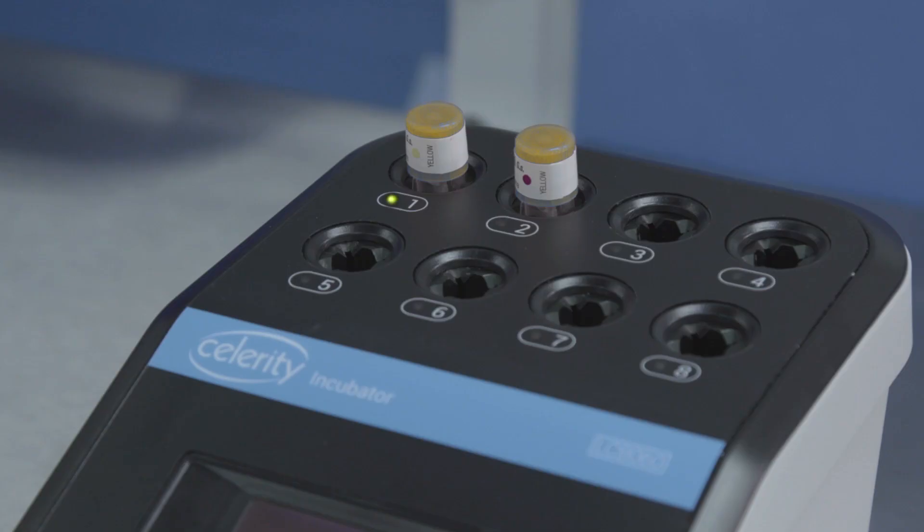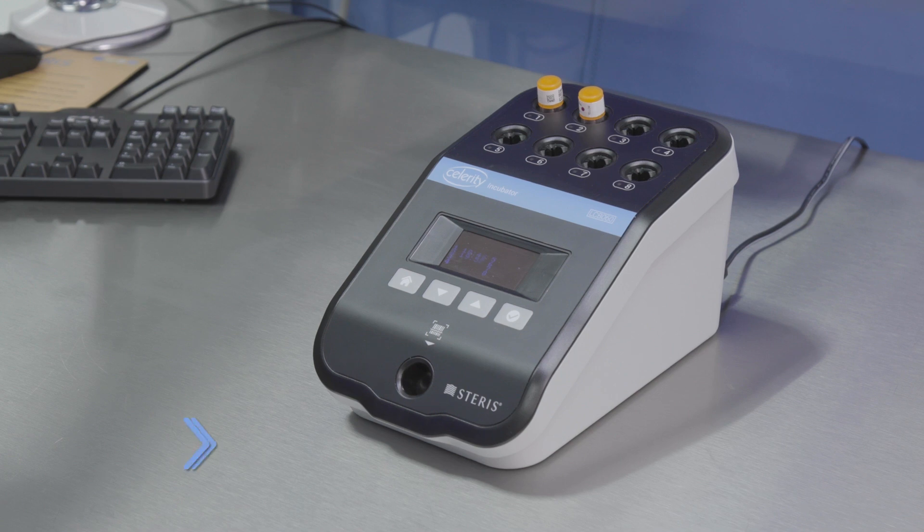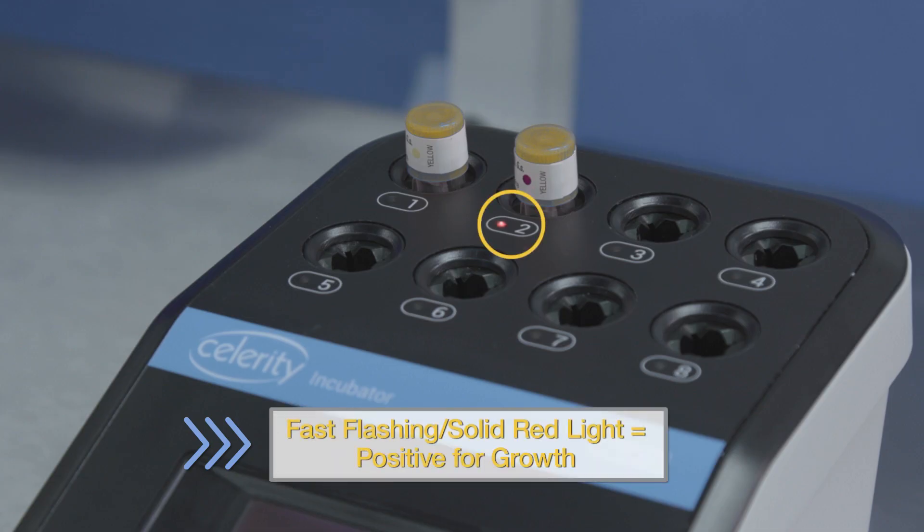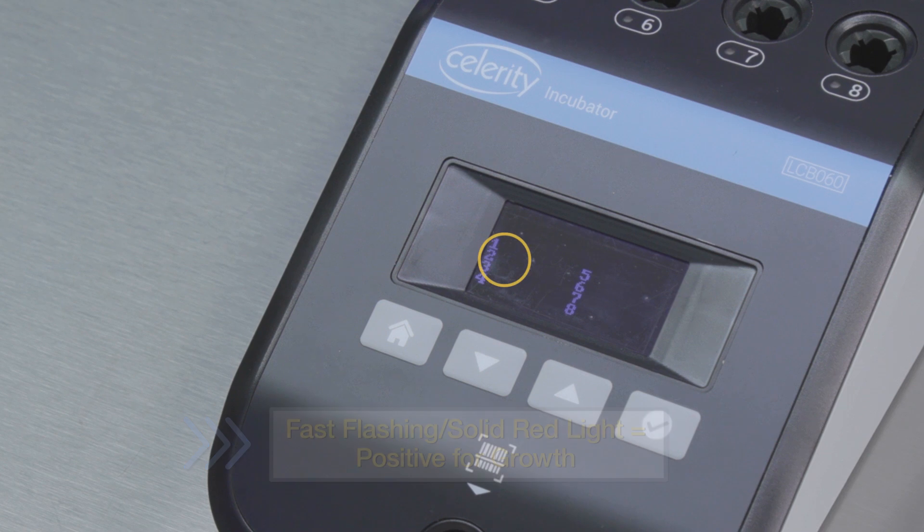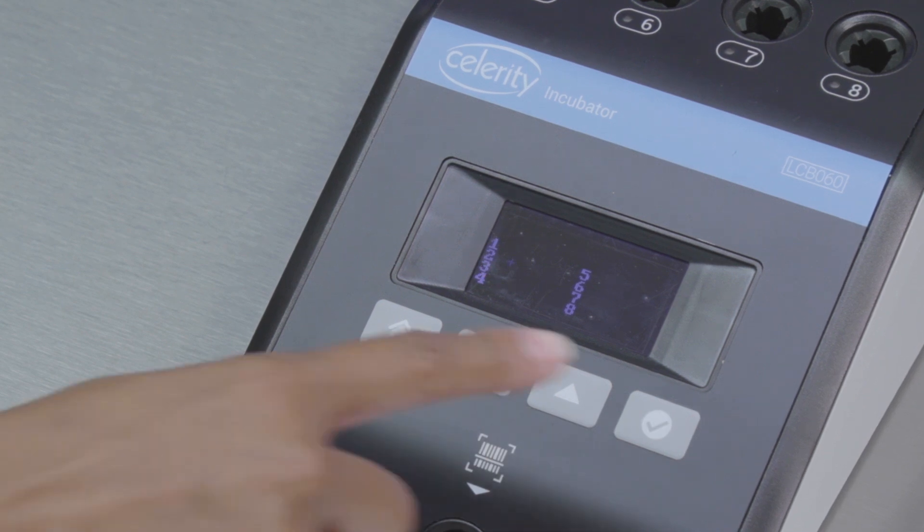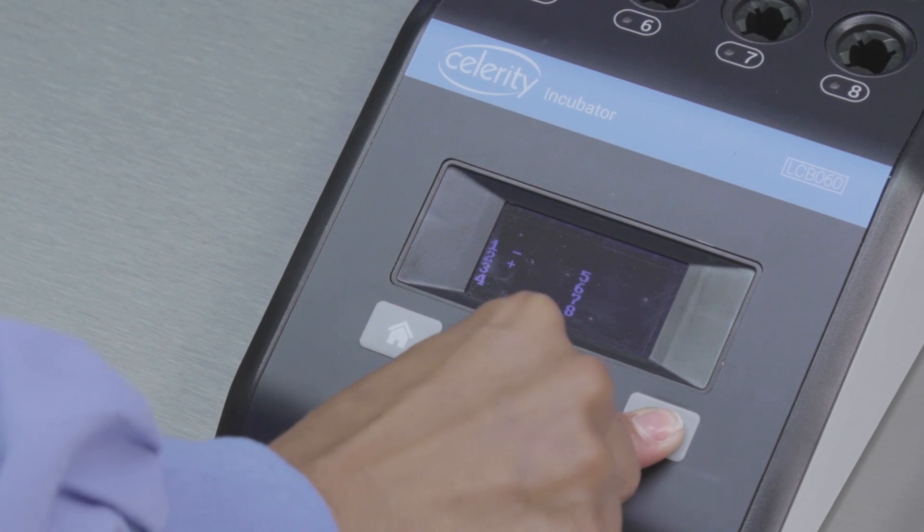The BI is positive for growth when the incubator demonstrates a fast flashing red light, as well as an audible alarm and a plus sign on the screen next to the corresponding well number. Acknowledging the result will silence the alarm and the LED will turn solid red.